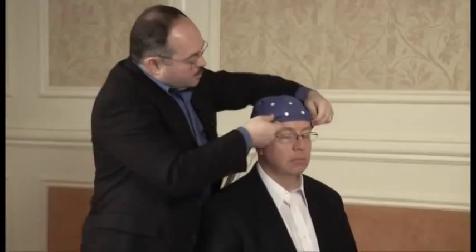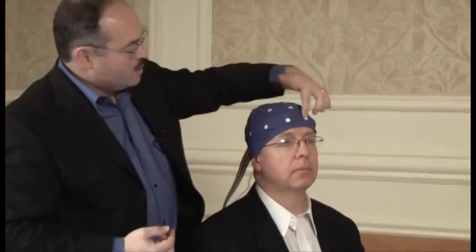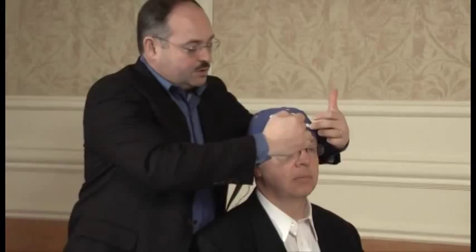There is a front and a back to the cap. The tag goes to the back. You can put the wires for the ear clips and ECG sensor also in the back when you apply the cap. You'll see that there's FP1 and FP2 over the frontal poles. Line up at the center of the eyes, and the midline sensors go right down the middle.